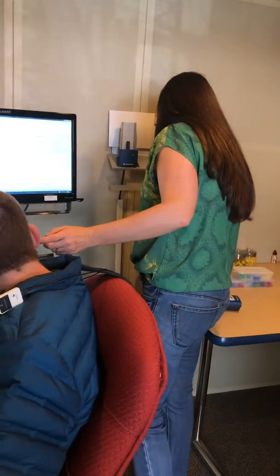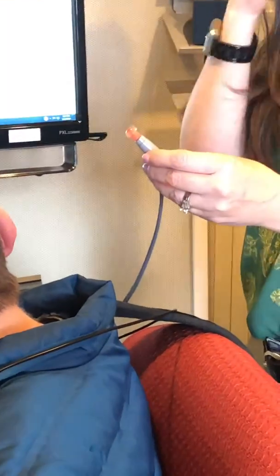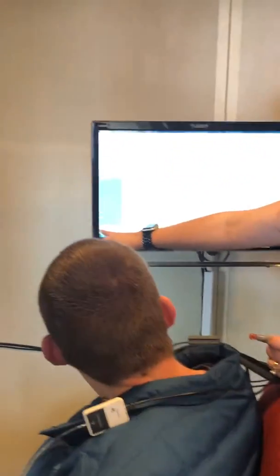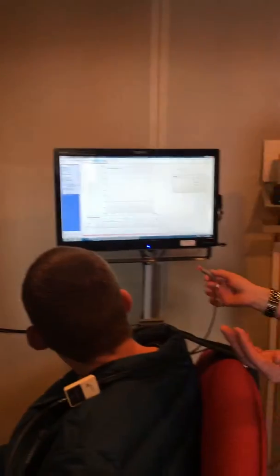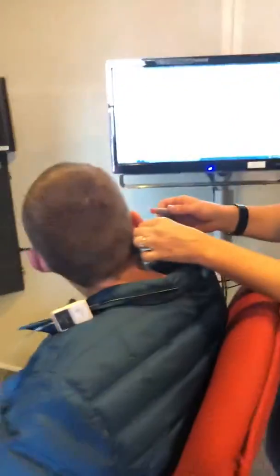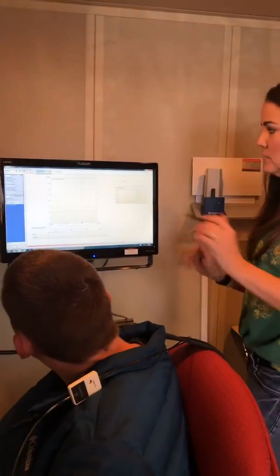You have to remember to select the appropriate size tip — one that seals perfectly in the outer portion of the canal. Don't go deep in the ear, don't use a small tip. The setting here says 'T+RT,' which means tympanometry plus reflex thresholds. It's really automated, which is nice. I pull up and back on the ear, place the tip in, give it a little twist to seal it, and then I'm ready to go.